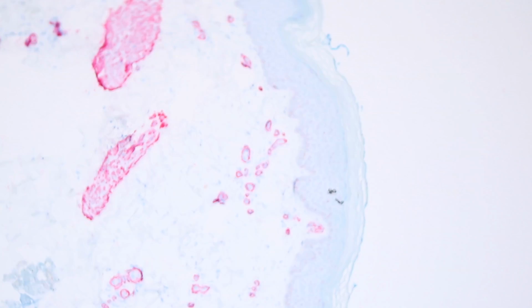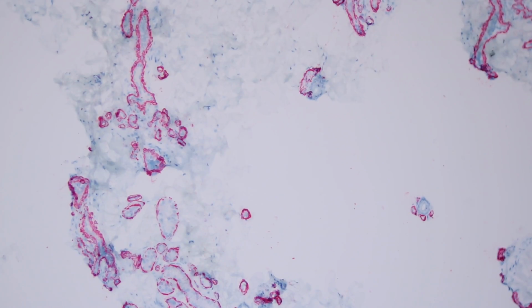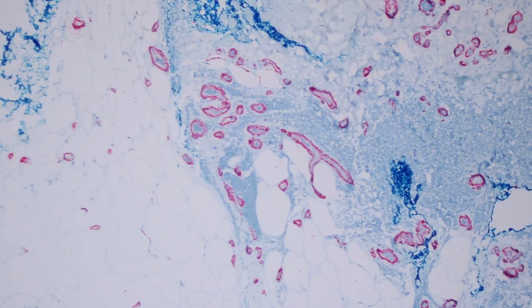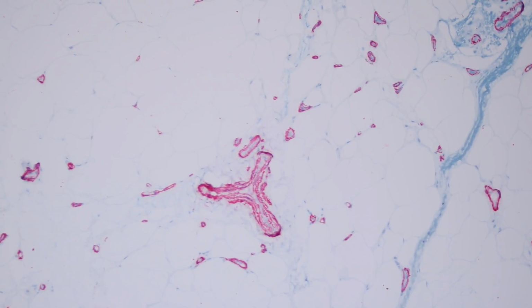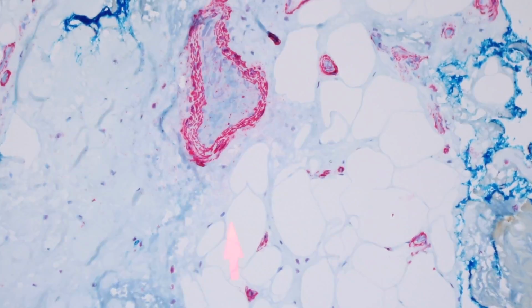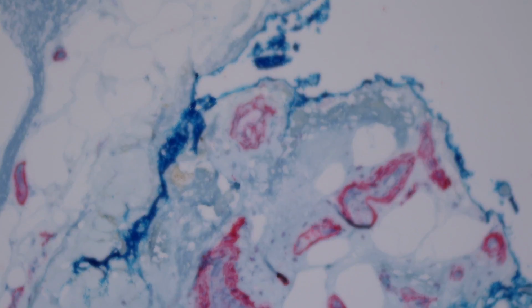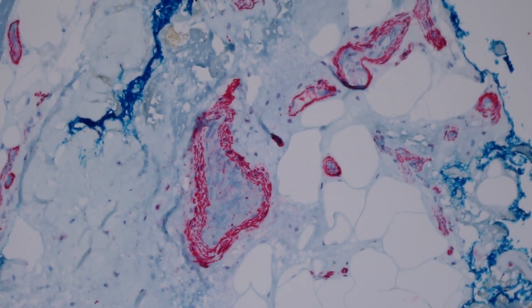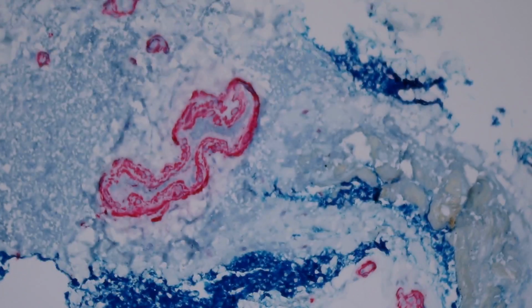And then larger vessel walls are going to actually have a full muscular layer, and that's going to be positive for actin as well. As we go down here deeper, we can see in the subcutis this kind of triangular shaped, kind of funny squished vessel, and it's got a nice layer of smooth muscle actin in the muscle wall. Here's another one. This vessel has been burned by cautery a little bit, but you can still see the outer muscle is staining, and the endothelial cells are negative, even though they've been, again, crushed and burned a little here by cautery.